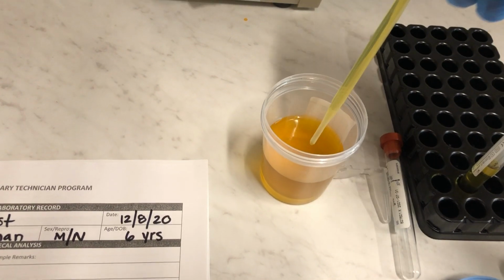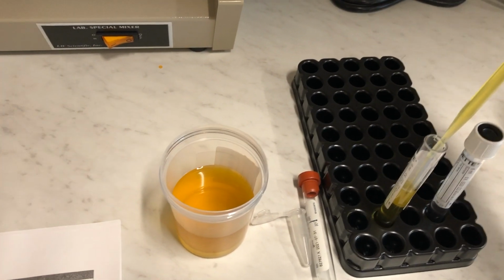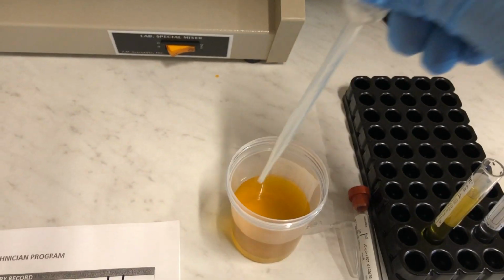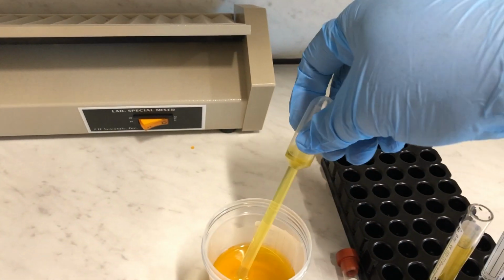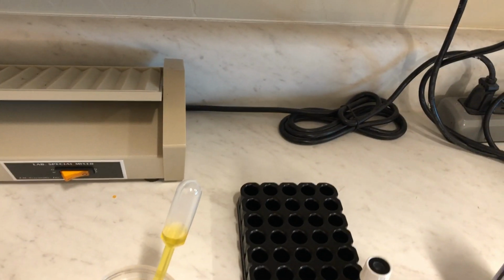And if this urine sample had been sitting on the counter for more than a few minutes, I would want to make sure to stir it up or invert it a couple times, just in case the cells and the solid matter had time to settle to the bottom. So that tube is full enough, and then I'm going to fill the pipette one more time for the rest of the tests. I'm going to go ahead and place my cap back on my white top tube.